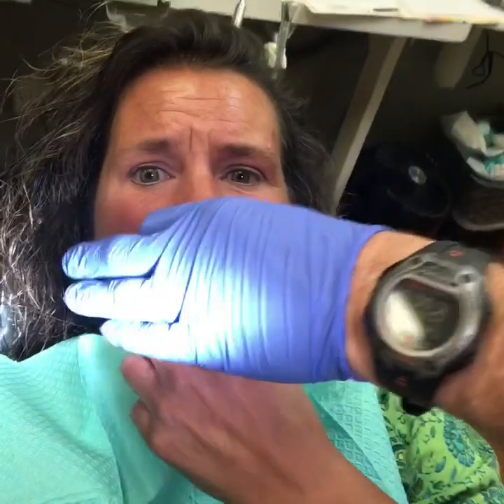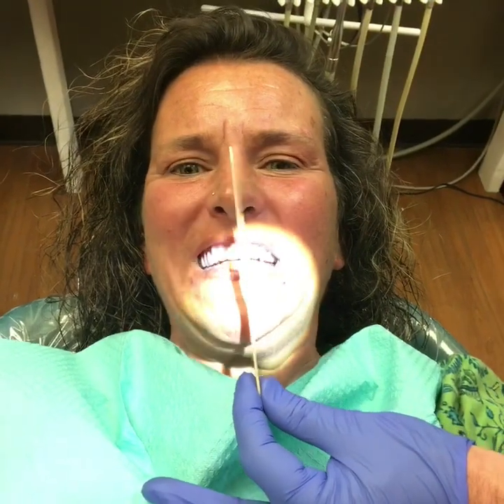Okay. A couple things we need to look at for her. What do you think? It feels so big. Well, the palate's still in there. And the flange is really high up there still. I'm probably going to have to trim the flange away. Okay. Let's look at the midline.